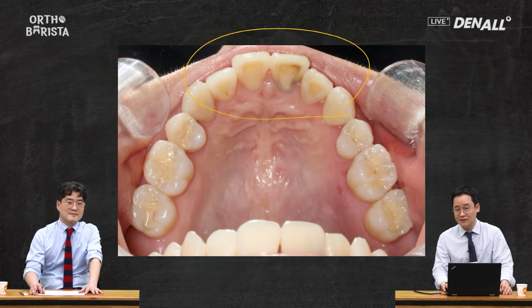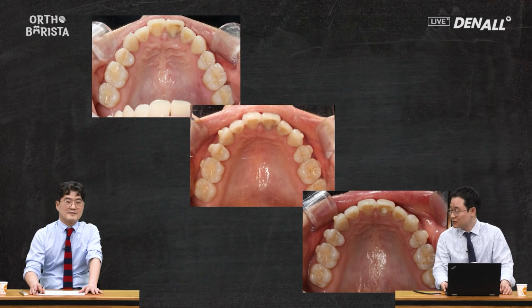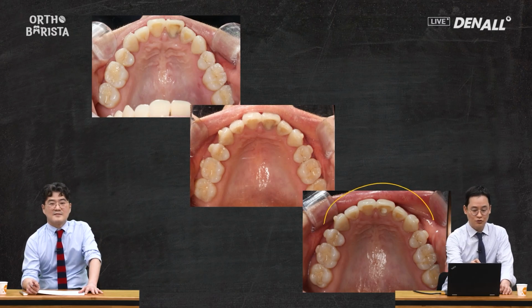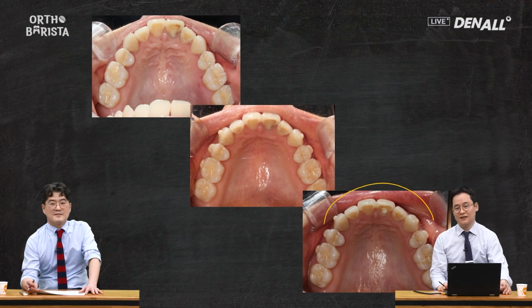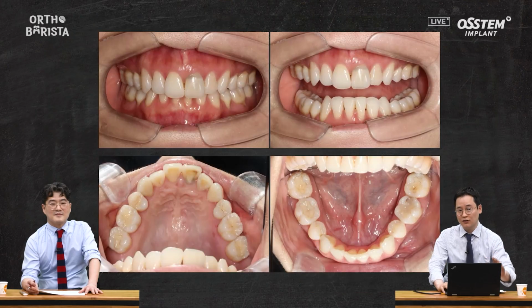So, clear aligner treatment was started and continued for about 4 months. After that, the teeth were aligned perfectly. The treatment seems finished. At first glance, it might seem like you could just say, "All done, goodbye." But there are crucial considerations in this case.